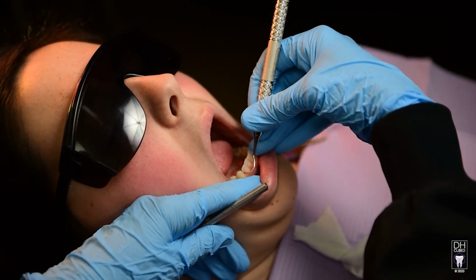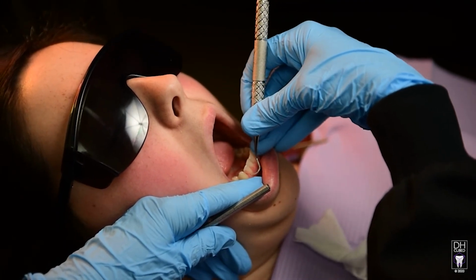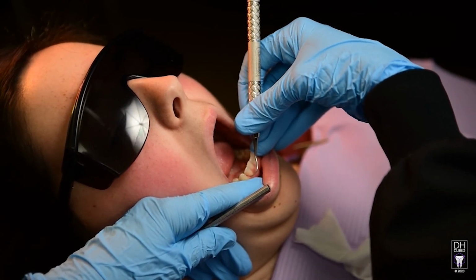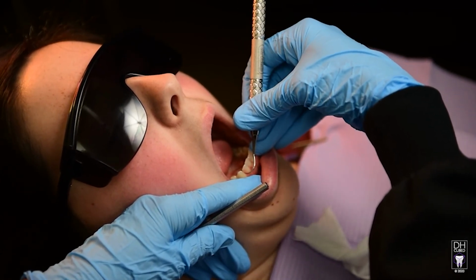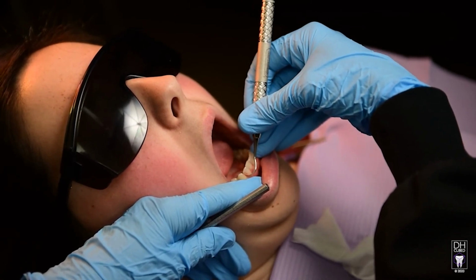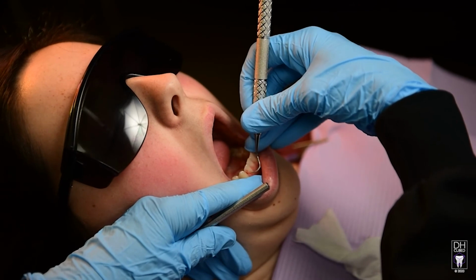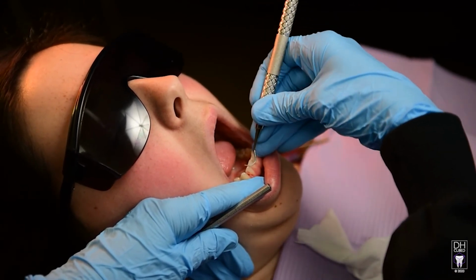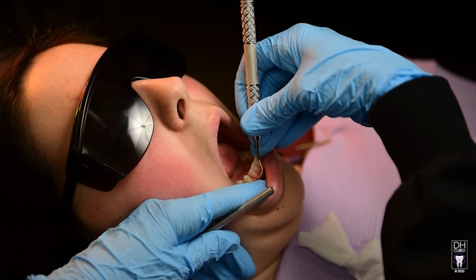If you find yourself pressing harder and/or closing the blade further and further, these are the first signs of dullness and clues to stop and sharpen. Don't cheat yourself by saying, "I don't have enough time to sharpen." This is the very mindset that will keep you from providing the best care to your patient and lead to potential hand injury because you are working too hard.